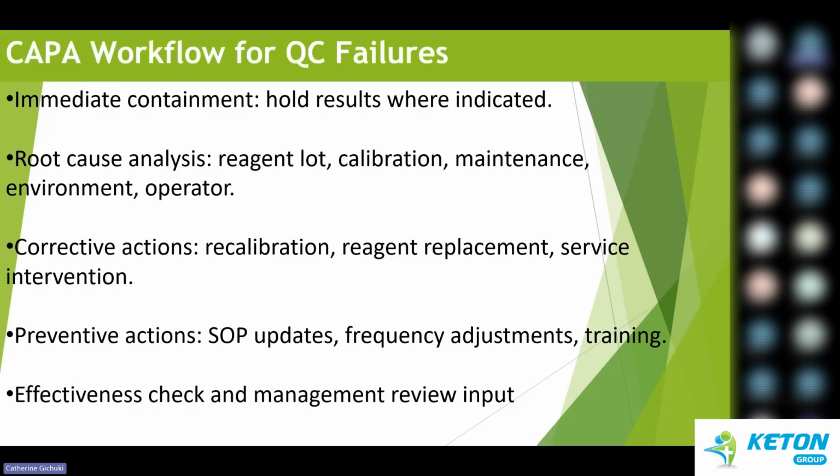Then, after you hold, don't just keep the results there. You want to do a root cause analysis as soon as possible. You want to find the real cause. What is the common cause? Is it a reagent issue? Is it a calibration problem? Is it a maintenance issue? Is it an environmental factor, for example temperature? Is it an operator error? So you want to check what is the real cause.